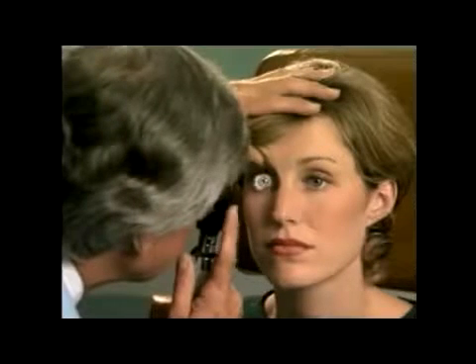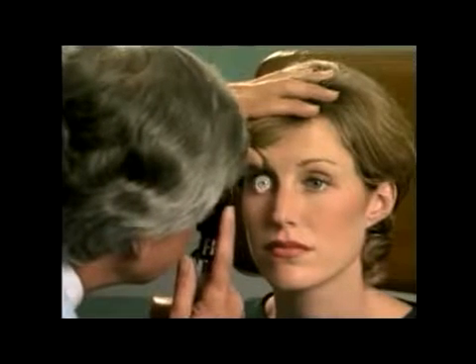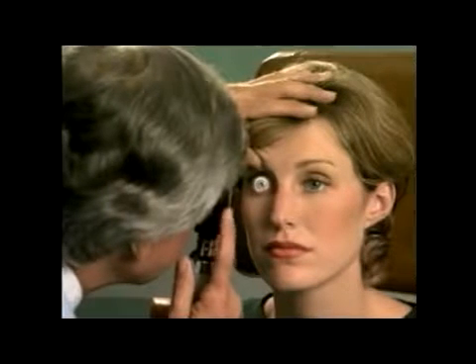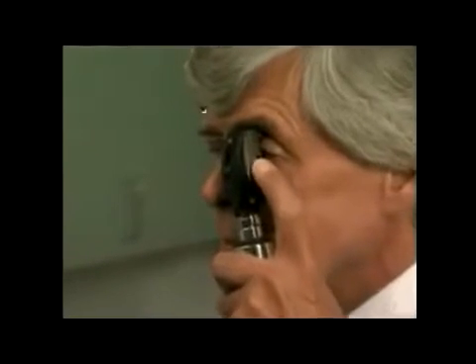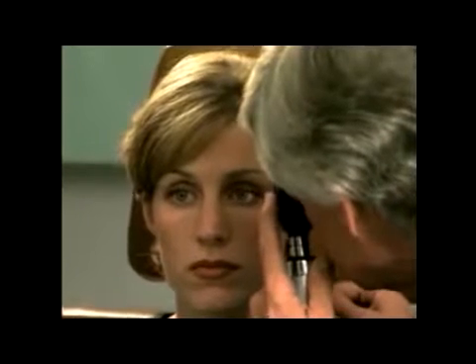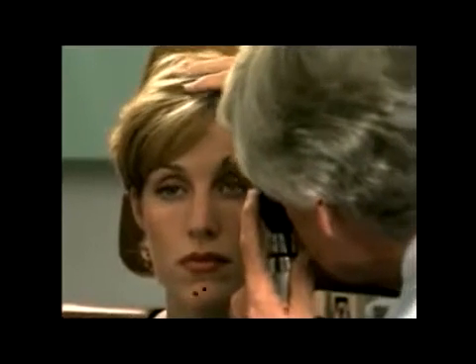Following and practicing these steps will help you examine your patients more thoroughly and detect many pathologies manifested in the retina. Finally, to examine the left eye, just repeat the procedure we just outlined. As with any procedure, the more you use your ophthalmoscope, the more proficient you'll become at performing this exam.